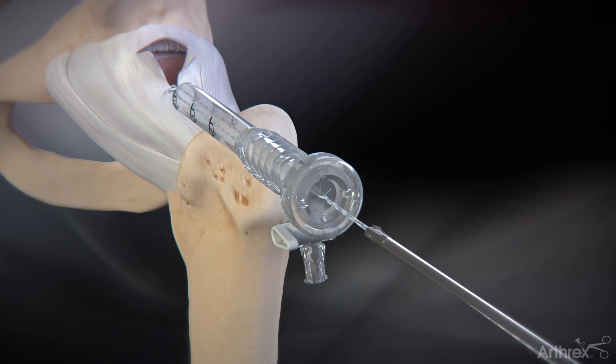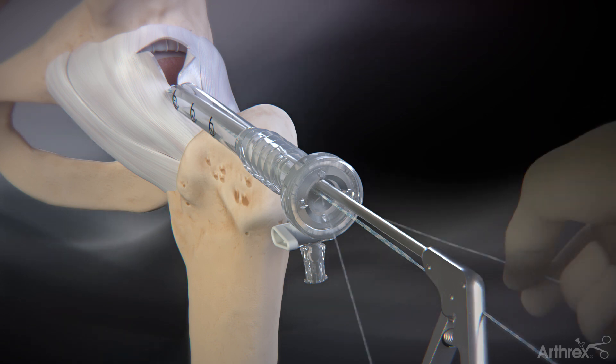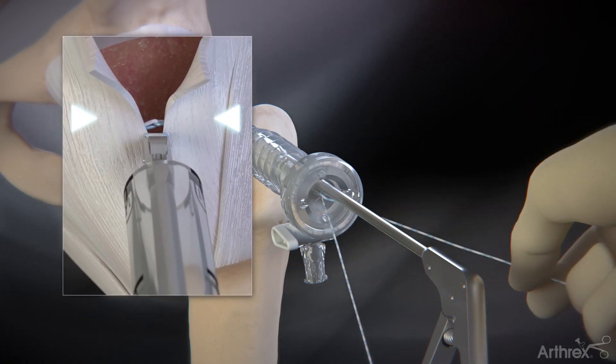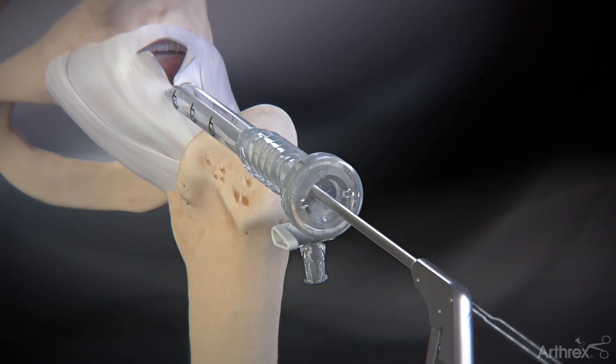Feed both limbs of the suture into the jaws of the closed suture cutter and advance it until it is fully seated against the loop-lock suture. Pull each strand of suture for final tensioning and squeeze the handle to cut the suture.